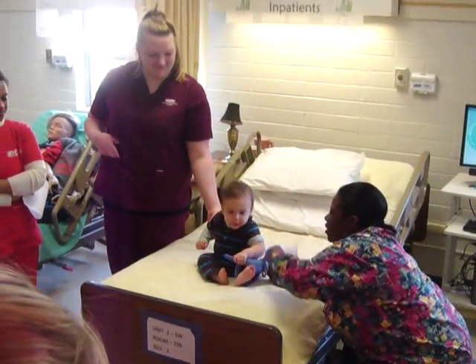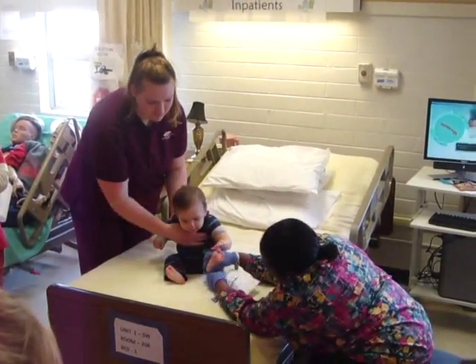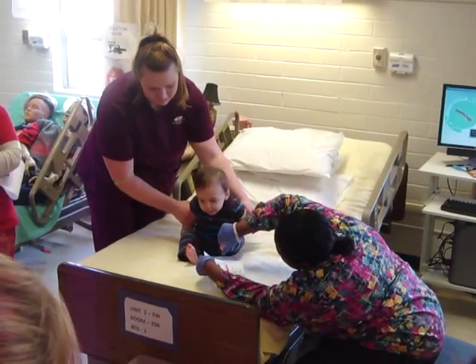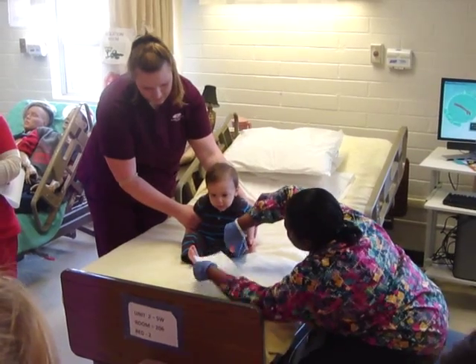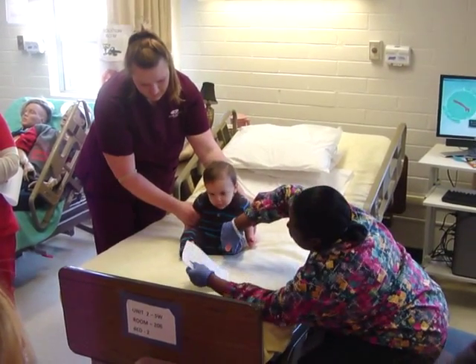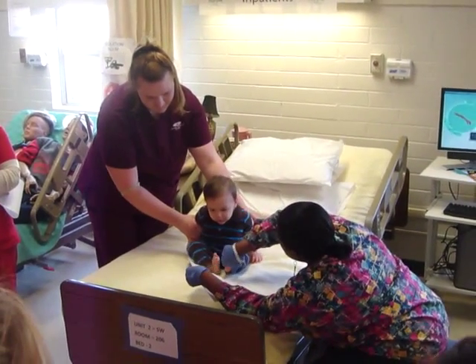Mom, can you hold his hand for me? Thank you. I'm going to squeeze, squeeze, squeeze like this — then blot. Squeeze, squeeze, squeeze — blot. Squeeze, squeeze, squeeze, get that good droplet going — blot. Almost done.